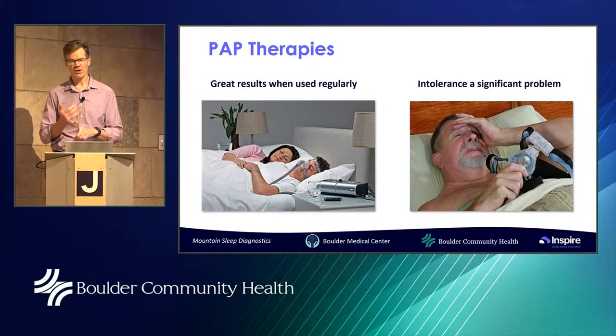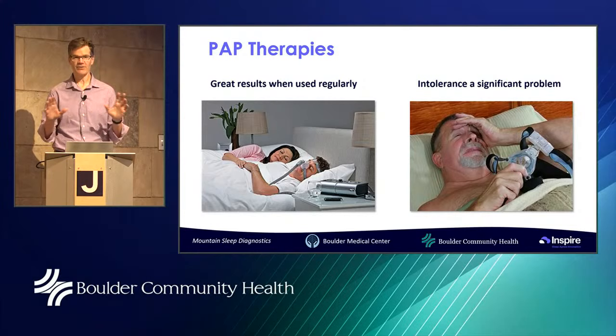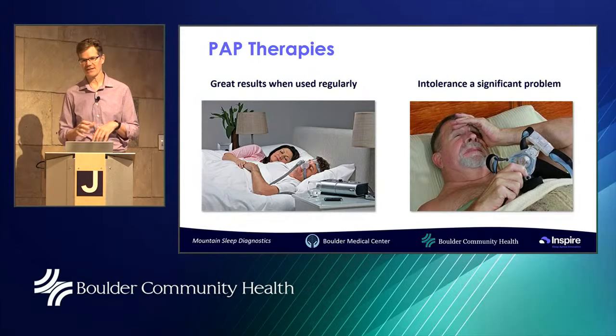you really need to try to sort out what the problem is. I have a lot of patients whose CPAP has been in the closet for 5 years. I'll see them and say, let's try it again. Let me try adjusting the pressure. Let's get you a better mask. Let's try changing the humidity. Let's get you different headgear. And I'll try changing the pressures again. We can work with different things to help you tolerate CPAP better. I don't have a 100% success rate, but I'd say over 50% of patients who initially say no way, we can get them to try it.